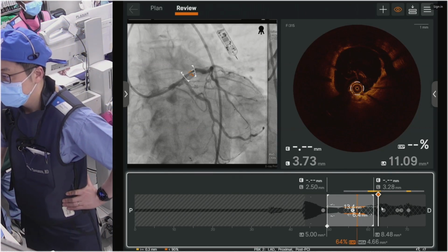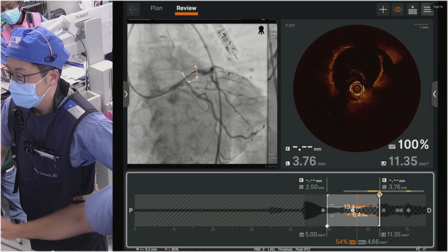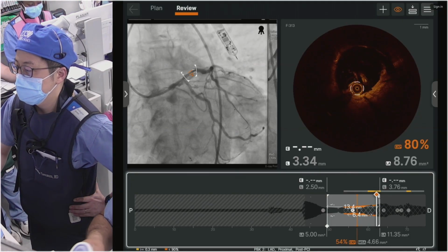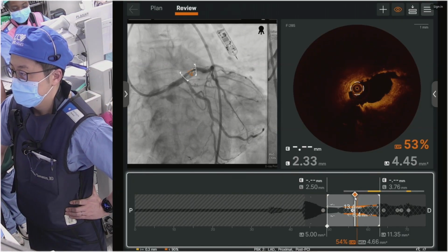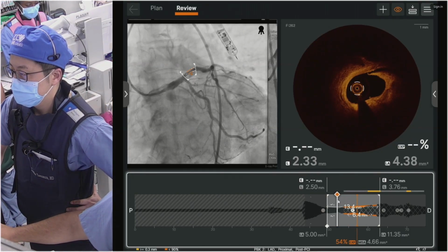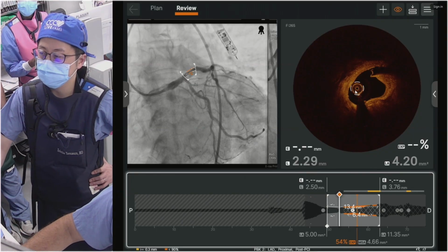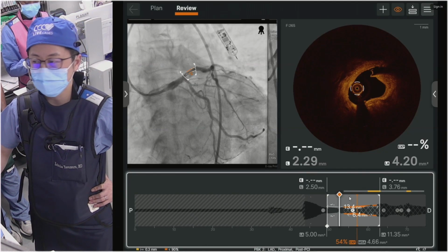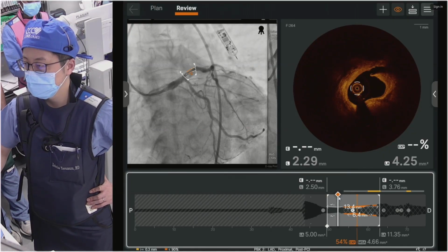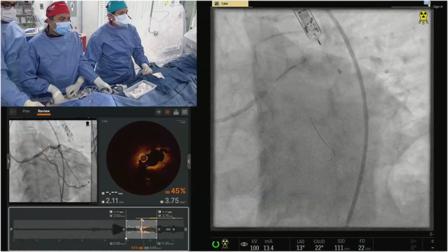The hematoma makes you think that the vessel is larger, but the vessel is not that big. So I will go. Inject some dye. A lot of contrast. And the tightest part is again half plaque free, so it's better not to go aggressive. It might cause another perforation. Okay, so we are not going to go bigger. No, we are 3.5. Yeah, so that's the safest one.